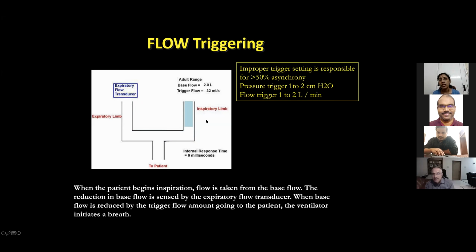See, you look at the size of the flow here. Only half of it goes back, so the ventilator will sense there is a loss of volume. So it gives an inspiratory flow, and inspiration sets in. This is only when the patient is communicating to the ventilator.